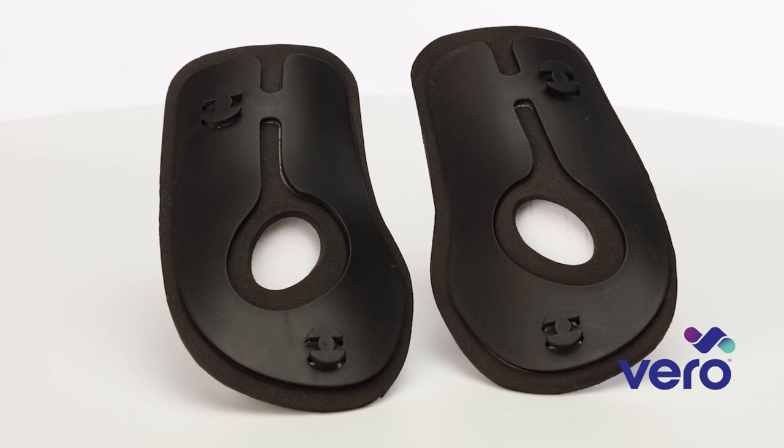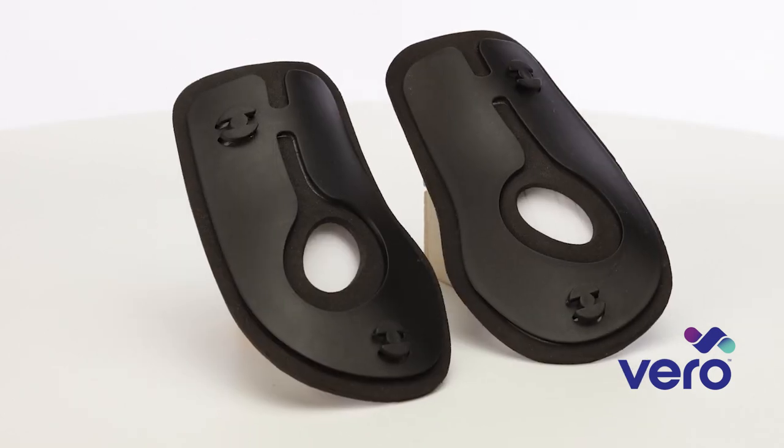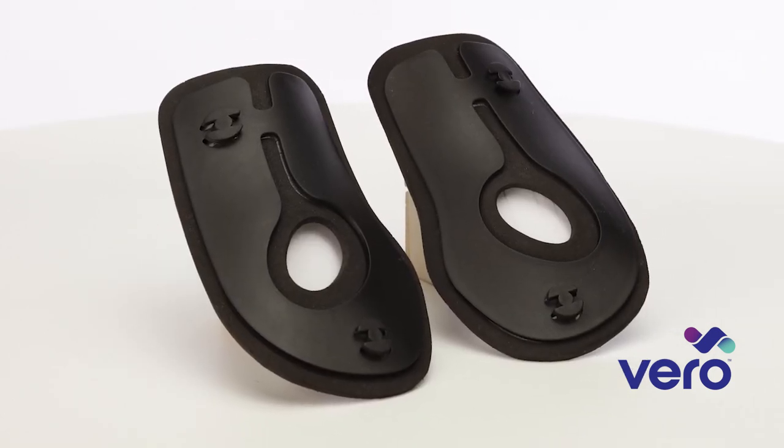The Vero Ankle Brace includes these modular stirrups. This important feature provides the necessary support and stability at the beginning stage of an acute and more severe ankle injury. As the ankle begins to stabilize, the stirrups can be removed as the injured ligaments or bones begin to gain strength. Once the stirrups are removed, the patient adjusts the straps to snugly fit the healing ankle for comfort and support.